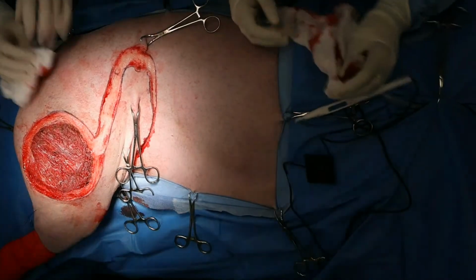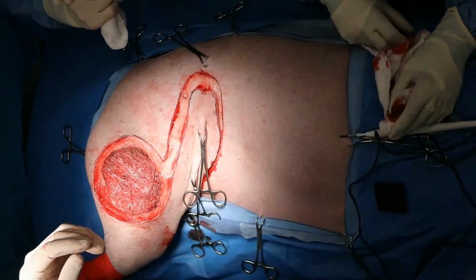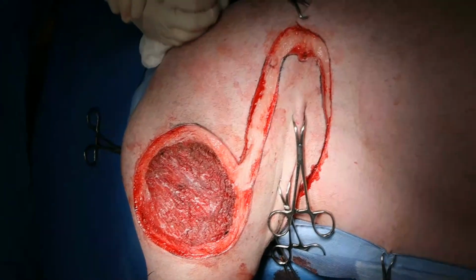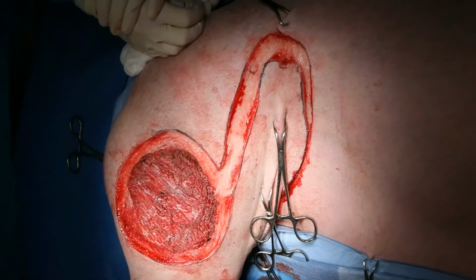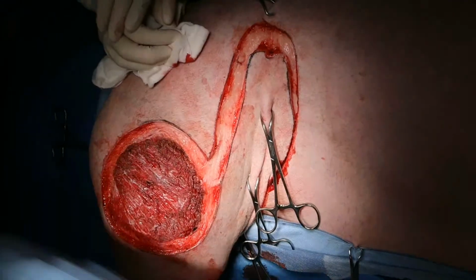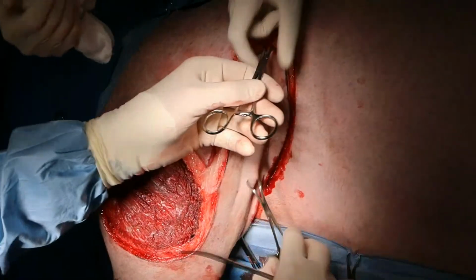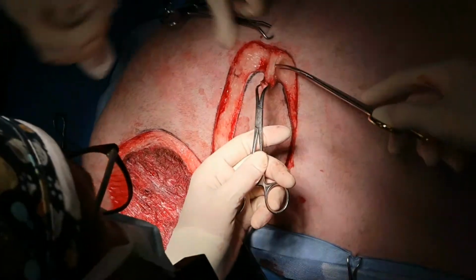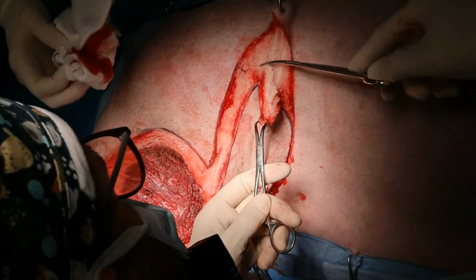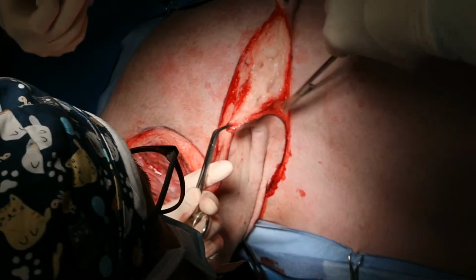So what I might do is just try to re-aim the camera a little bit and zoom in. All right, so now I'm going to use my scissors to elevate the flap so I don't cause vasoconstriction on the feeder vessels. And just lift this up here, and just get ready to put pressure down on the bed if I cut something big that wants to bleed. I'm going to keep a lot of fat with the flap.